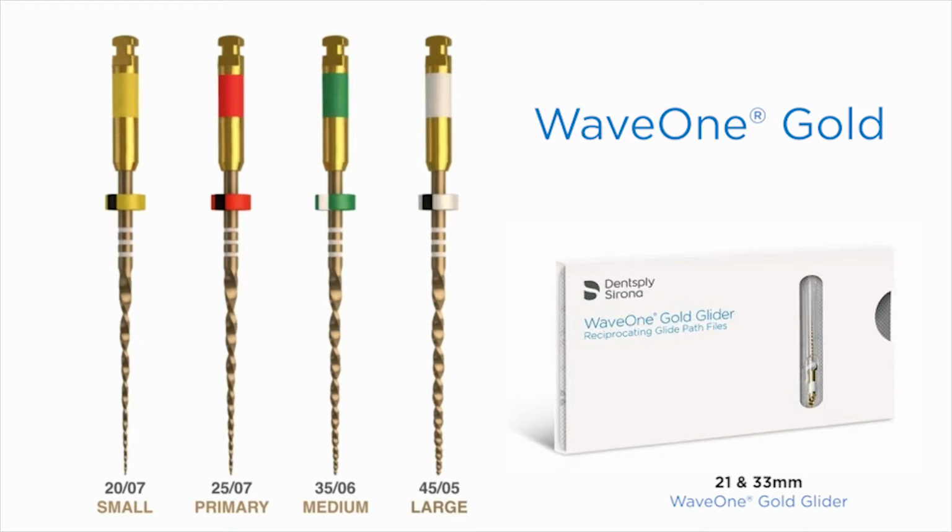With experience sometimes and based on a preoperative film that reveals a large system, one might, after a glide path, select the medium file, for example. But generally, I want to keep repeating, it's the primary file that's usually the first file into any particular system. So let's talk a little bit about why one might need another file, either smaller or larger, in the range of anatomical cases that we see on a daily basis.